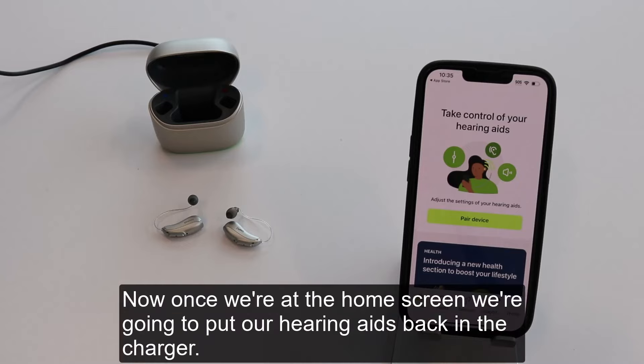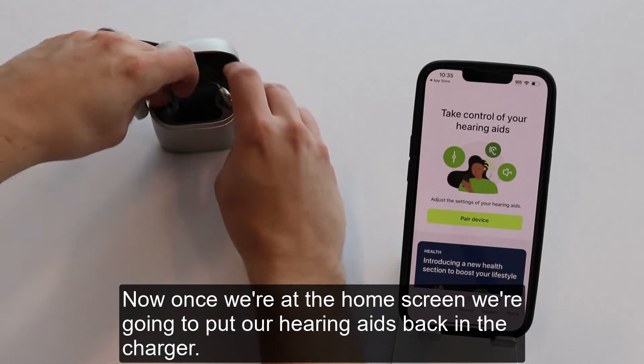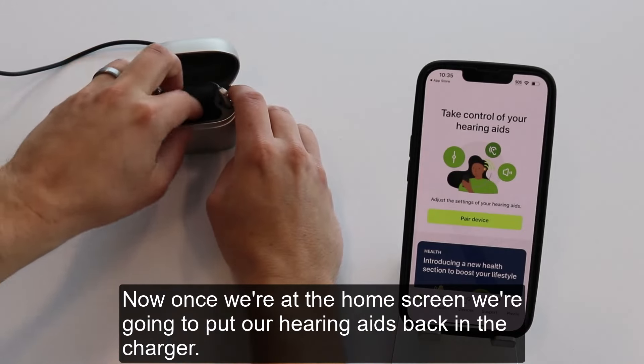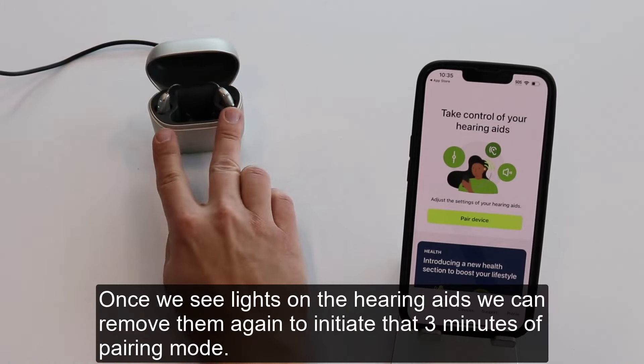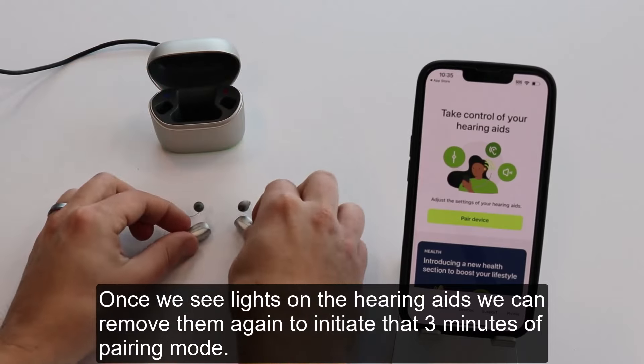Now, once we're at the home screen, we're going to put our hearing aids back in the charger. Once we see lights on the hearing aids, we can remove them again to initiate that 3 minutes of pairing mode.